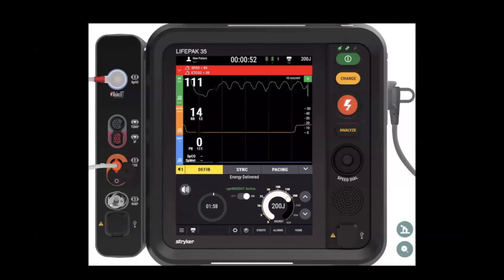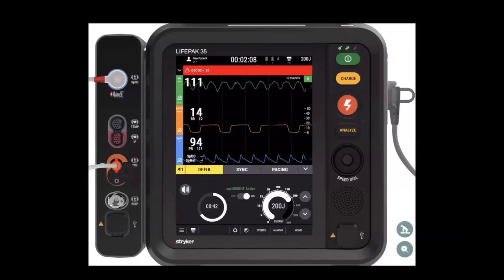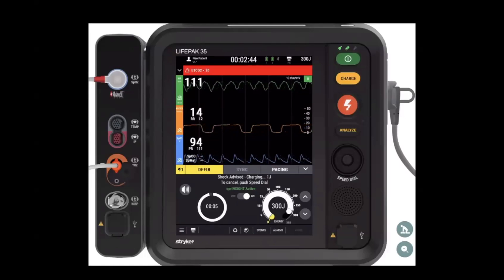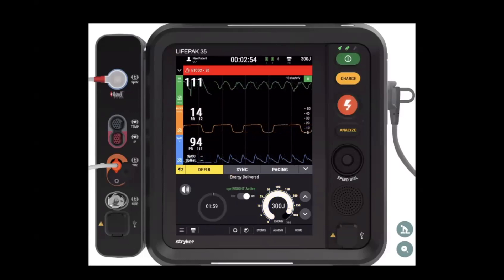So 200 joules, and we've got our end tidal waveform. Now let's fast forward two minutes — we do all other things. Notice our end tidal hasn't changed. Our manual or Lucas compressions have maintained an end tidal of 14. So do we think there's underlying perfusion? No. We've got our charge up. I trust that this one is true — the end tidal hasn't changed, the system detected it as a shockable rhythm. It's going to err on the side of caution. Very comfortable shocking through this.